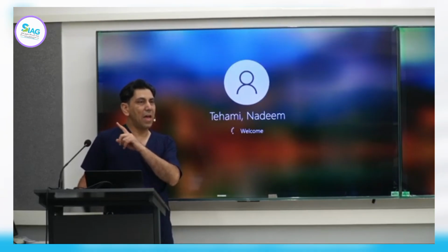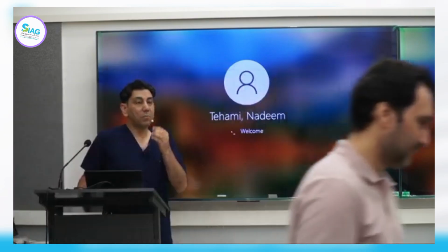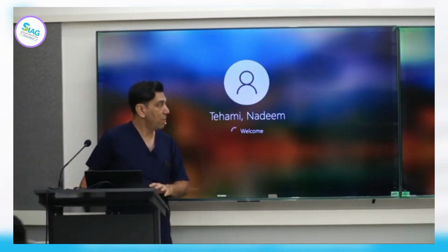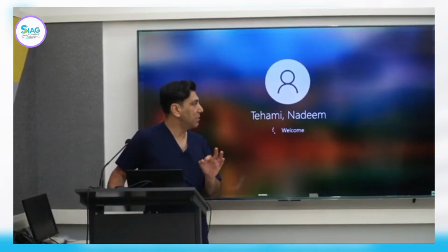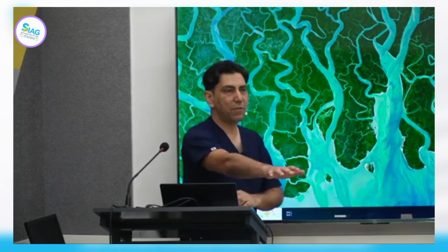Remember, there are two systems. There's an ME2 and ME3 system, and then there's another system, which is the Arietta system with the Fuji scopes and room Endo 1, which is much better compared to the ME2 system. With the ME2 system, the images are not very good. I don't tend to like the ME system images, because they are very granular. They're not as crystal clear. If you've worked in the ME2 or ME3 room and also in Endo 1, there's a huge difference. Slight problem is that the Arietta scope is a bit away from you.